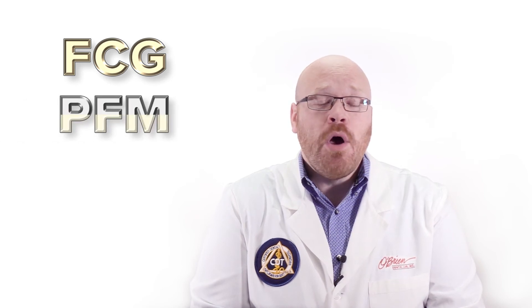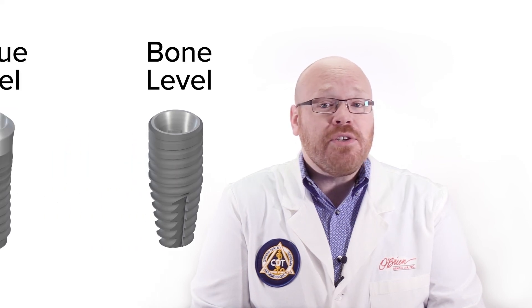This gives the lab the option to make a full cast gold or PFM, or to even press an Emax crown. And that's in addition to the digital workflow that allows for zirconia restorations. The angled solutions VarioBase is available for both the bone level and the tissue level implants.